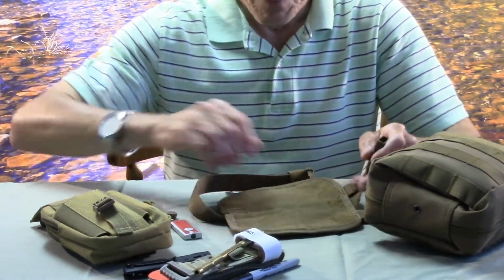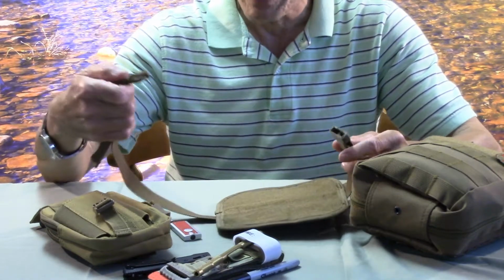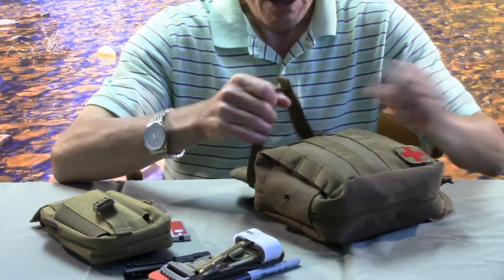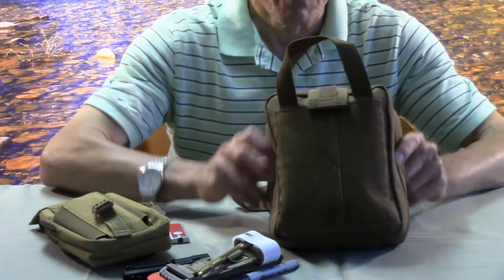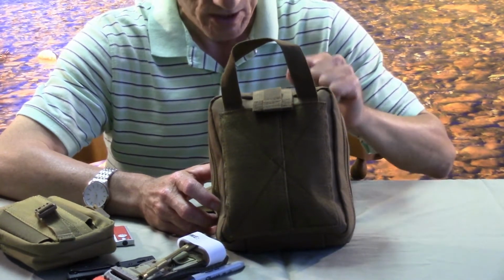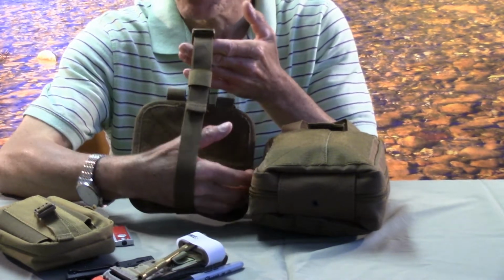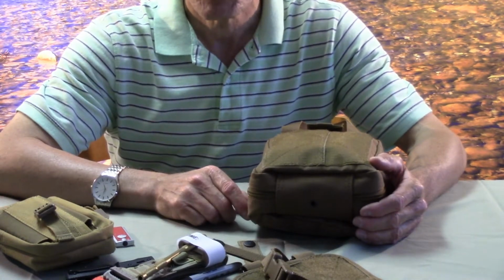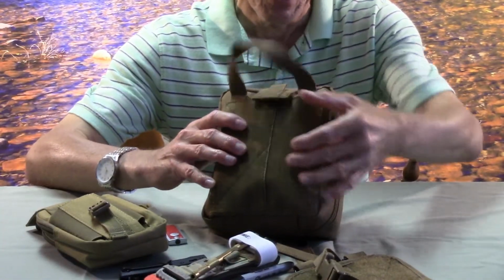One thing I probably should have shown you before I took it off the pack is this little belt here clips around your pouch so that it is not going to fall off. But honestly, that's a lot of Velcro there. You'd have to be extremely unlucky for that to pull off in the first place. But there's that additional security of this being wrapped around your pouch. So if you lose it, the sound of the Velcro tearing would be a dead giveaway. Yeah, really, you got a good point there, John.